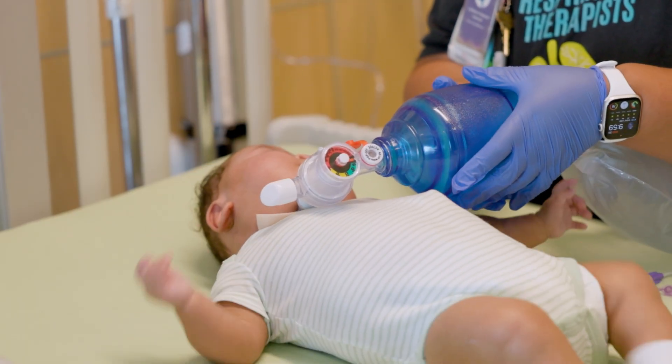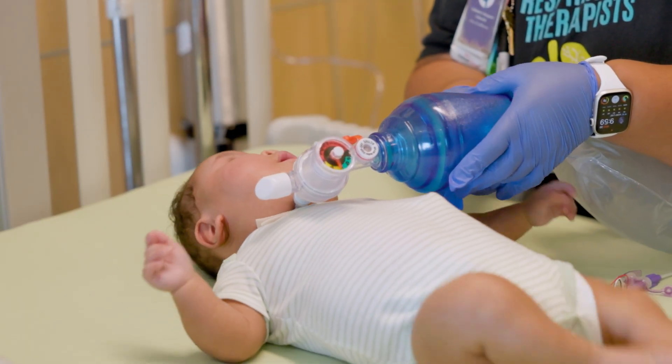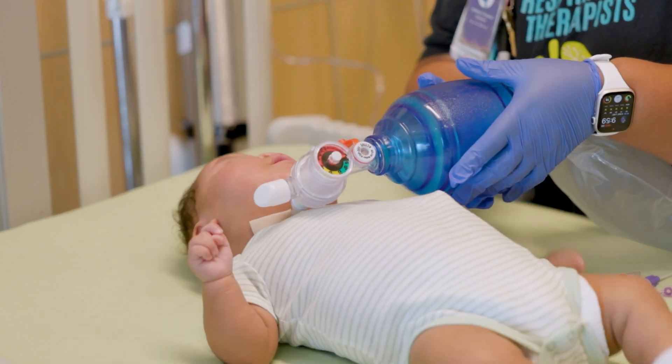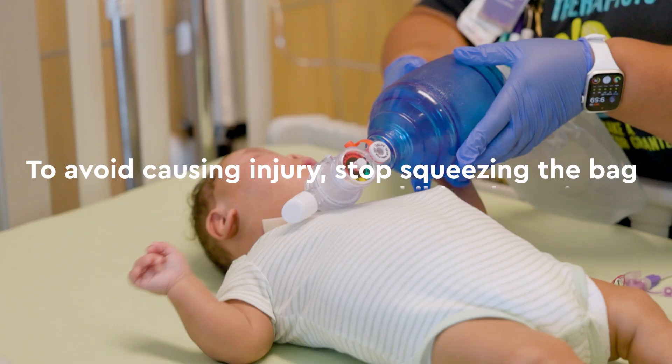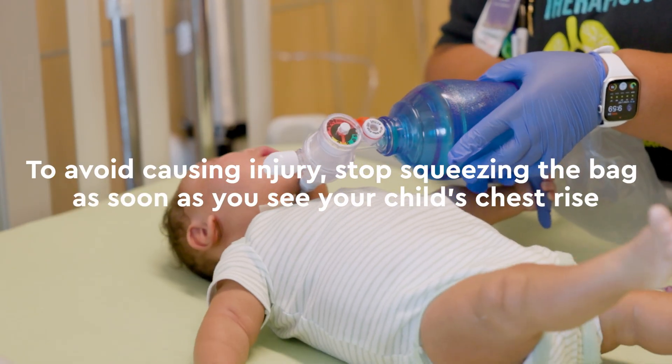Squeeze the self-inflating bag with a slow and steady pressure so the breath is given over about one second. To avoid causing injury, stop squeezing the bag as soon as you see their chest rise.